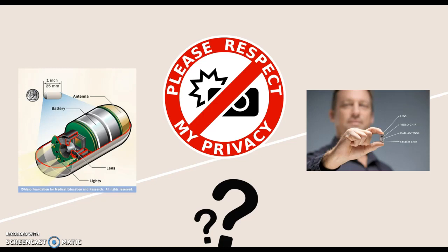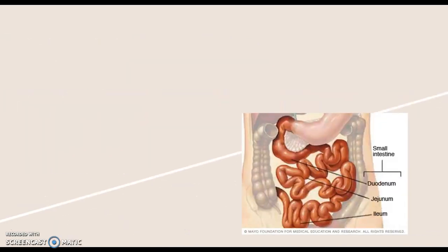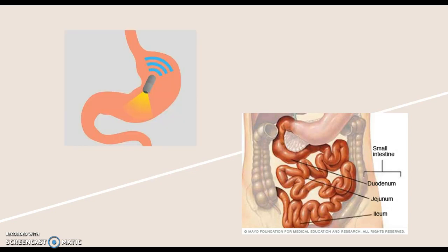Capsule endoscopy is a minimally invasive and painless procedure where the intestinal tract is examined through the use of pill-sized cameras. Other names for capsule endoscopy are capsule enteroscopy and wireless pill endoscopy. The easy-to-swallow capsule contains lights to illuminate the digestive system, a camera to take images, an antenna that sends the images to a recorder, all within a 1-inch pill, which is about the size of a vitamin. It helps doctors examine the small intestine, an area that is not easily reached with more traditional endoscopy procedures.